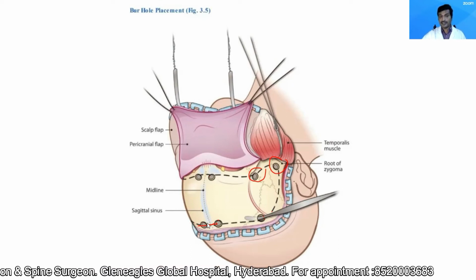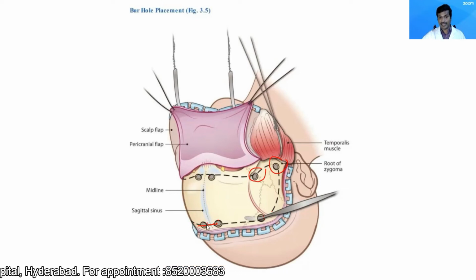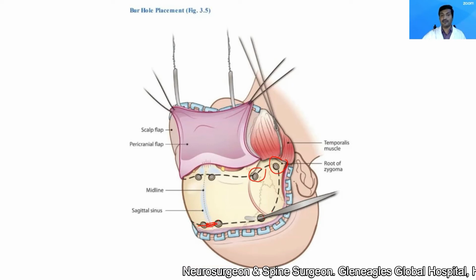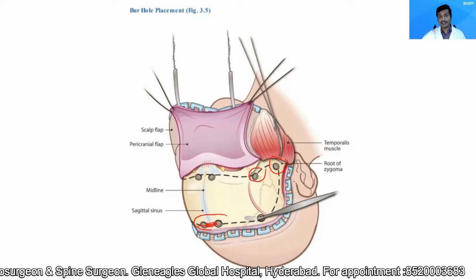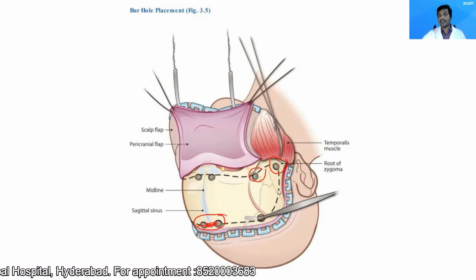Other people use a cutting burr followed by a diamond burr to make this bridge papery thin. Once you make it papery thin, use a dissector or a 1 mm upcut to join both burrholes. This part of the procedure is done last, only after connecting all the burrholes with the craniotome.